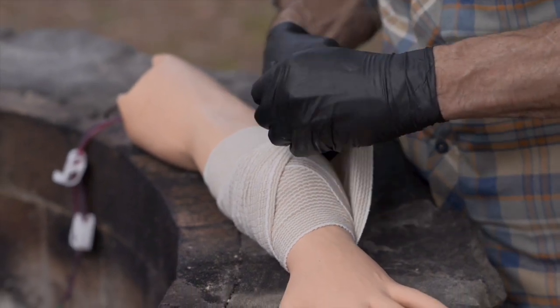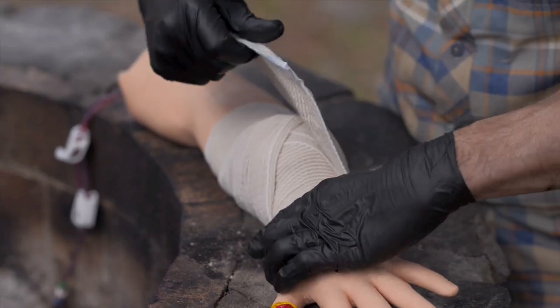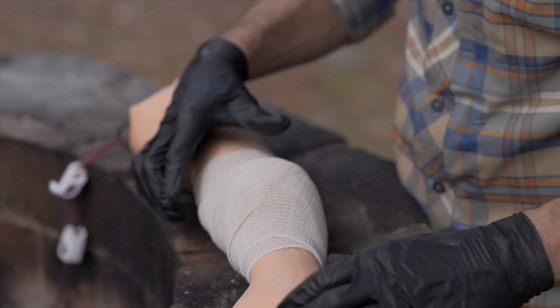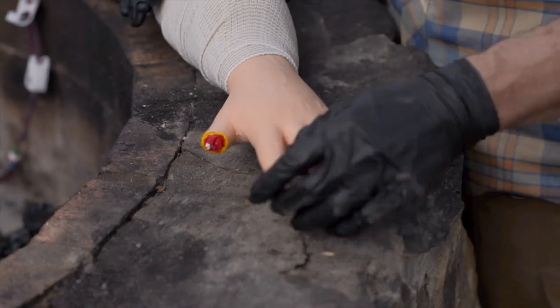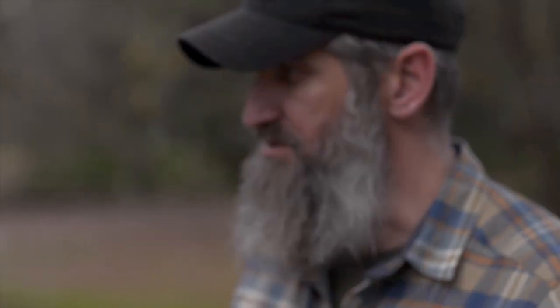And this one is handy because it has Velcro. Let's secure that in place. Check that radial pulse. Check the capillary refill to make sure you haven't created any sort of tourniquet effect. So that's another way that you can do this if you don't have an Israeli or an emergency trauma dressing.